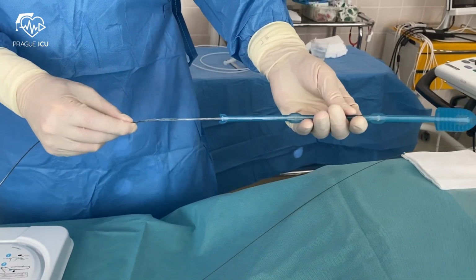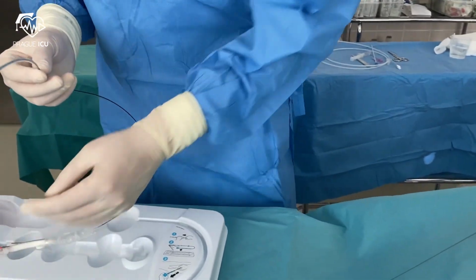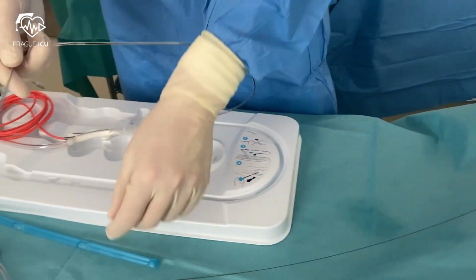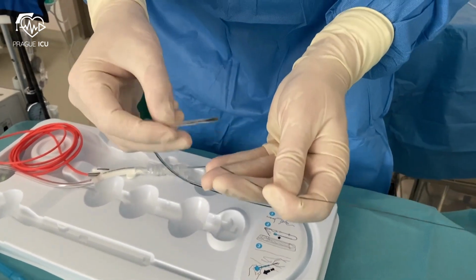Remove balloon catheter from a T-handle by pulling straight out to avoid damaging it, and insert it through the sheath over the guide wire until correct placement is achieved.